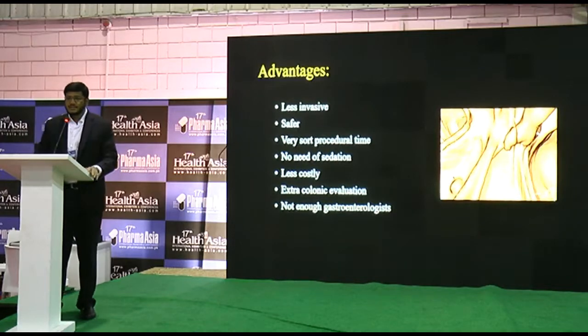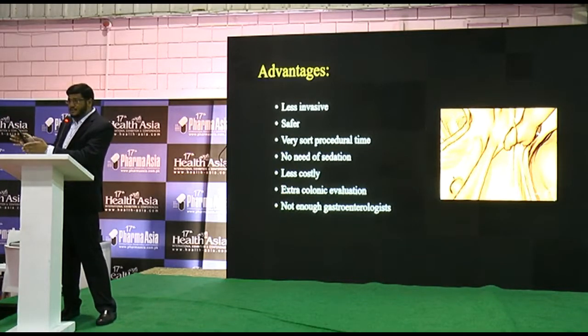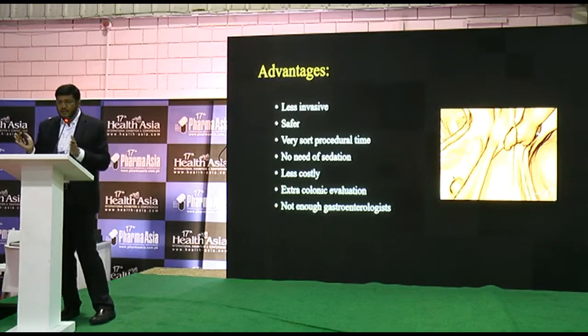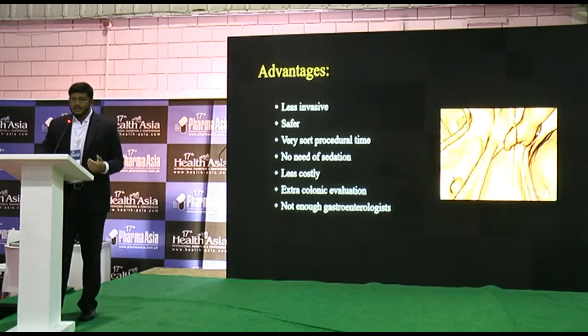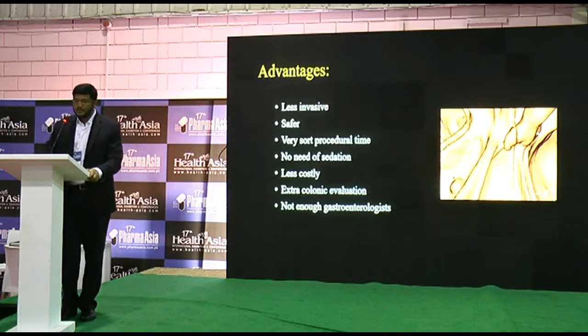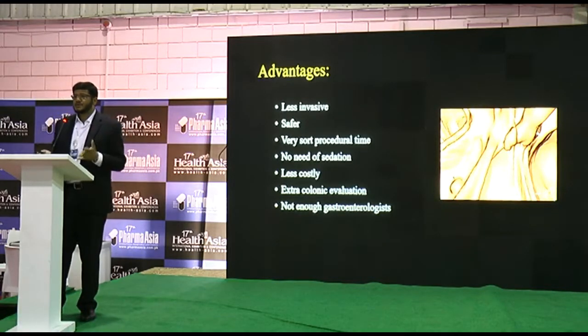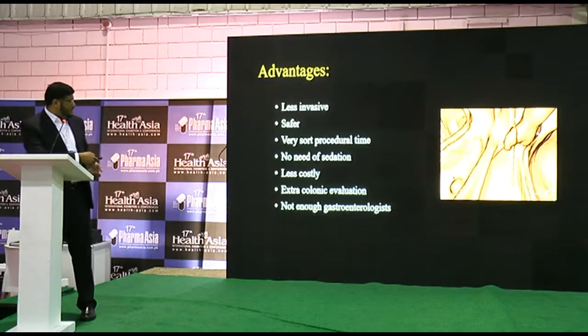So these are the advantages. It is less invasive, safer, and has a very short procedural time. The overall time from the patient coming into the CT room to going out is around 10 minutes, and the scan in supine and prone positions only requires 1 to 2 minutes. There is no need for any sedation, and it is less costly than optical colonoscopy in our setup as well. There is an additional benefit of extracolonic findings, which we cannot see in the optical colonoscopy exam. And a large number of gastroenterologists are not required to screen for colorectal cancer.